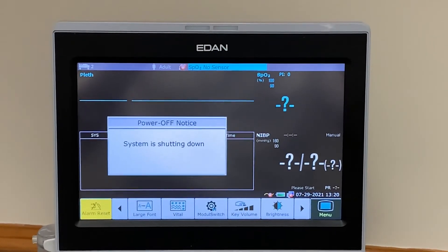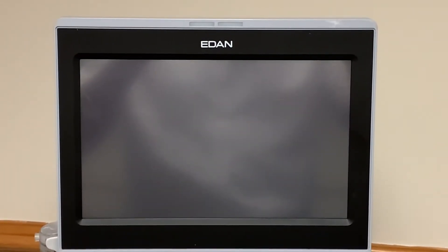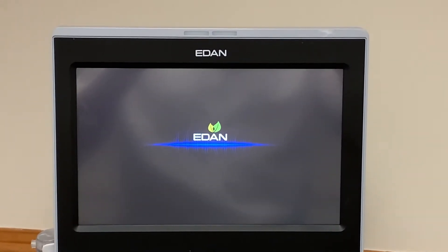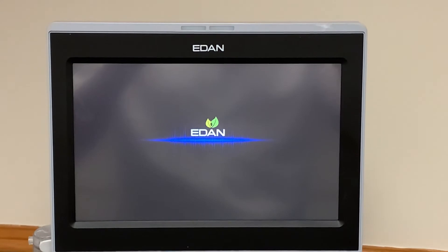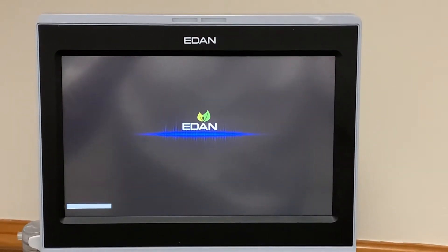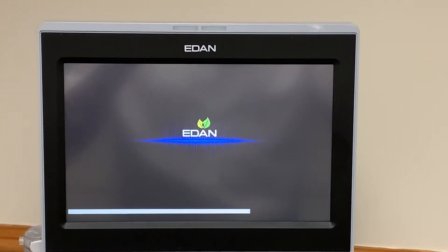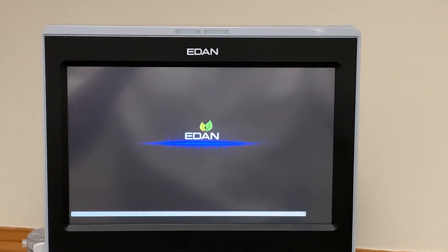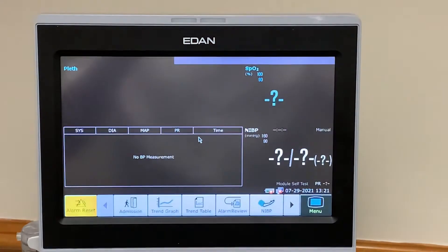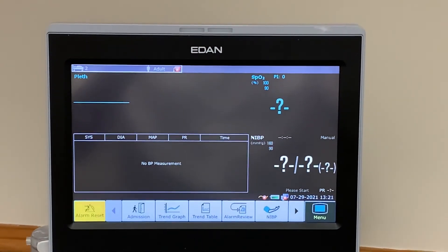I'll let the machine boot down and then turn it back on again. When you turn it back on, it'll go through reset mode. It will bring up the EDAN flash screen to start, and then when it comes back on, we should just be looking at SPO2 and NIBP. And there we have SPO2 and NIBP only.